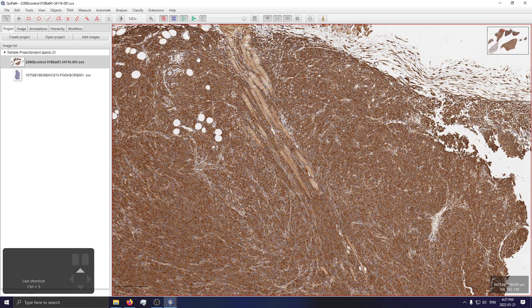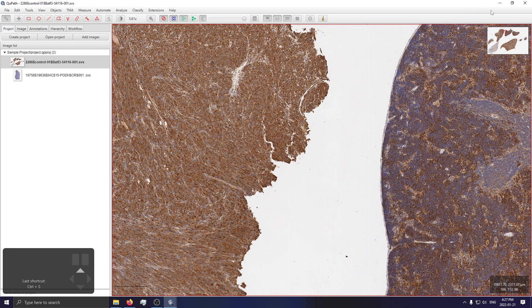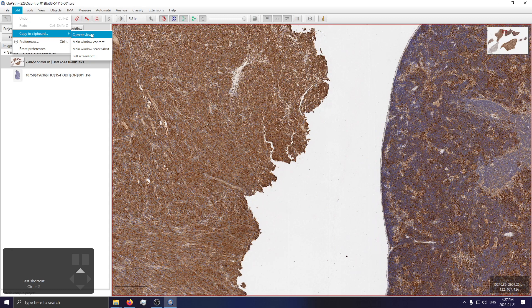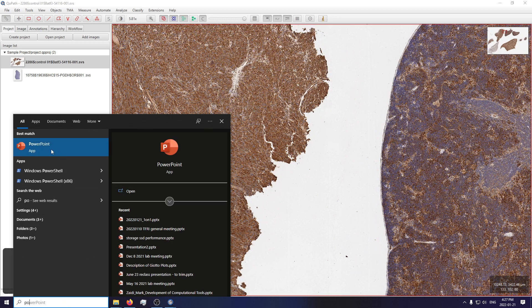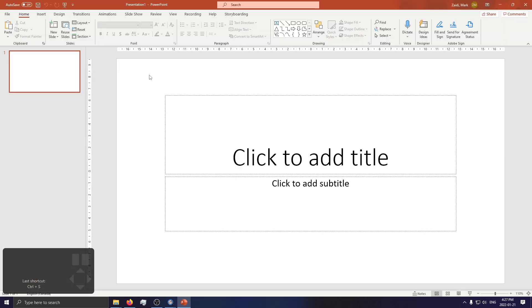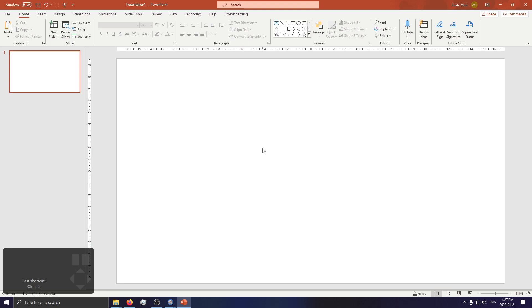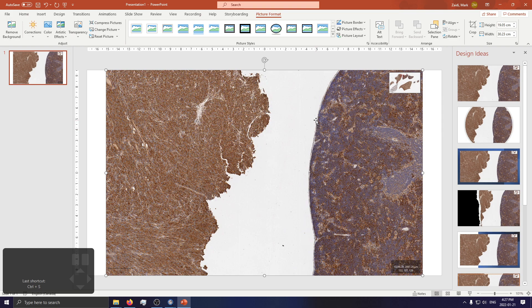At any point you can take a screenshot of what's shown in the viewer by going to Edit > Copy to Clipboard > Current Viewer. Once you've clicked it, you might think nothing happened, but it's copied. Go into Microsoft PowerPoint, do Ctrl+V (or Command+V on Mac) to paste it. This screenshot includes everything captured in the field of view: a thumbnail in the top right corner, a box showing the X and Y coordinates of your mouse, the R, G, and B values, and a scale bar below the brown DAB staining.